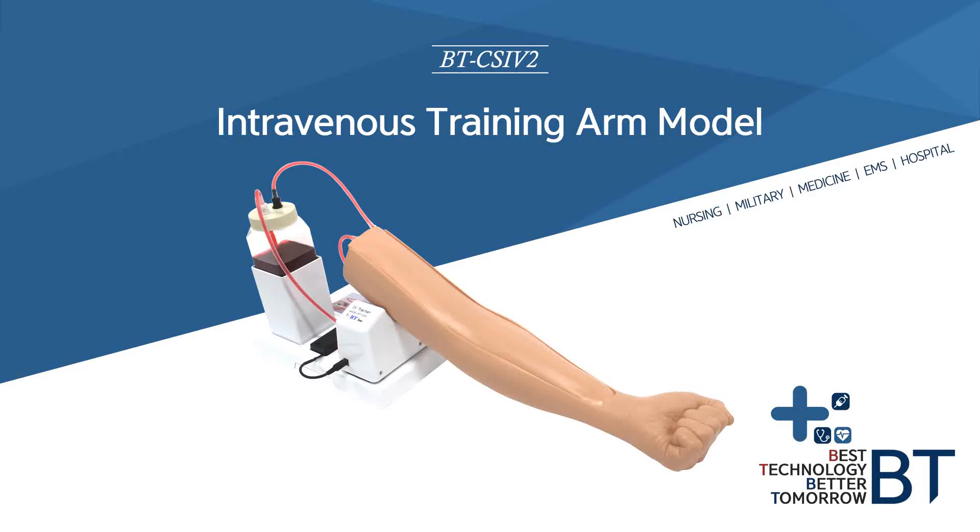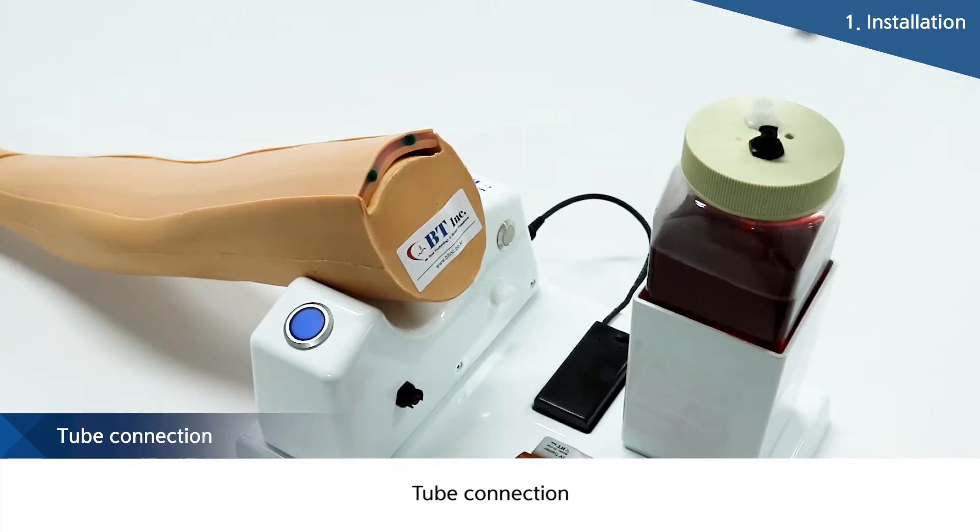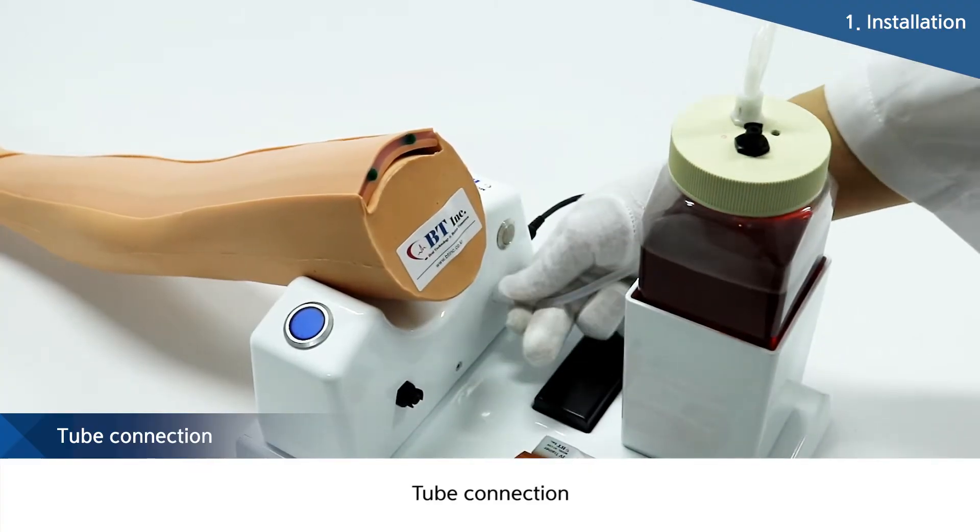I am going to explain about the intravenous injection training arm model. This product can be used for practicing intravenous injections.